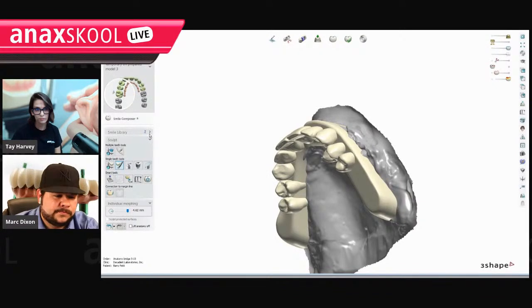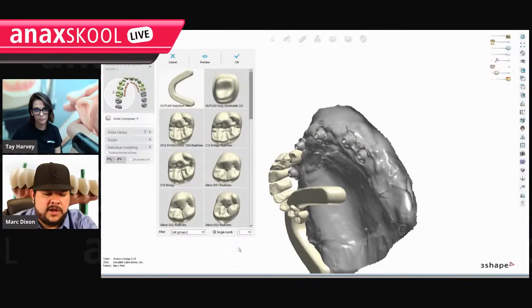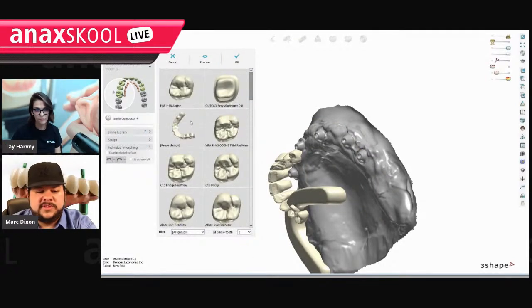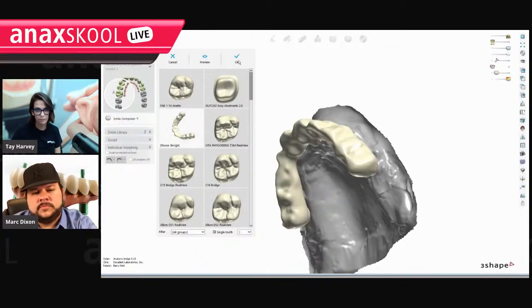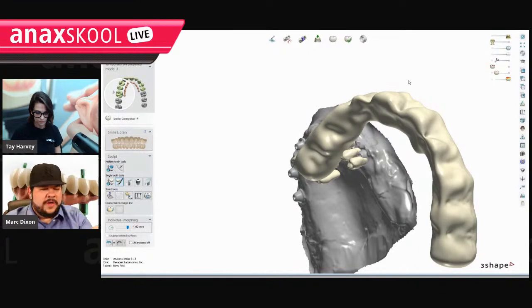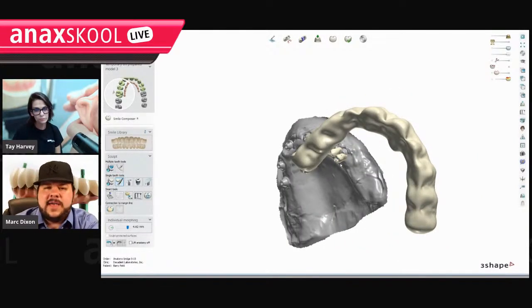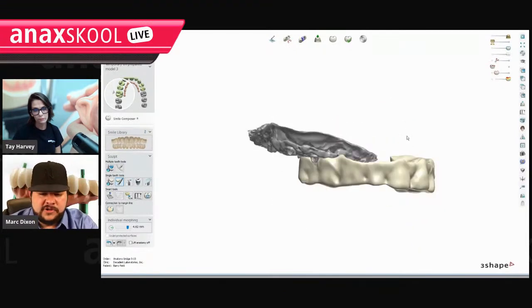What I'm going to do is grab the one I already used. So I have to go back to that being the actual tooth that it is and hit reuse design. All right. So we get our original design back. We finish our diagnostic. Those are two ways to add the gingiva. Another way is you could choose a single coping tooth and fake it, and that'll let you choose gingiva, but then you're drawing splines and everything. So either use an attachment or the library from exocad, and you have a gingiva ready to go. And there's one that's all textured and colored.